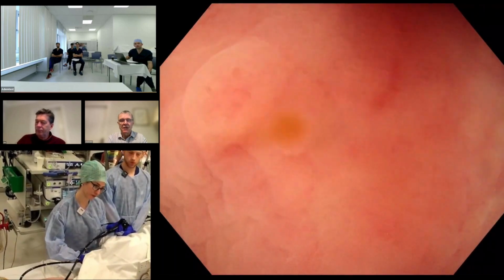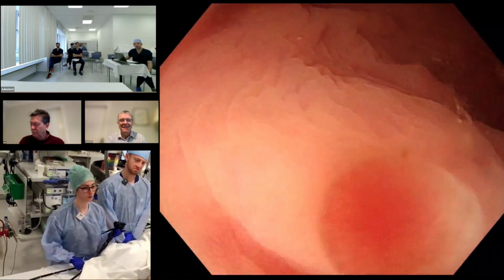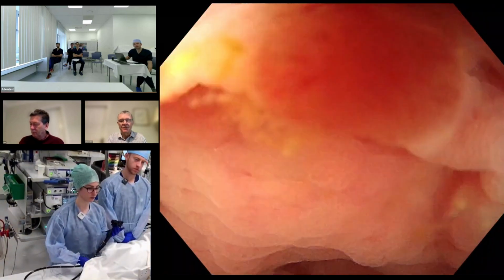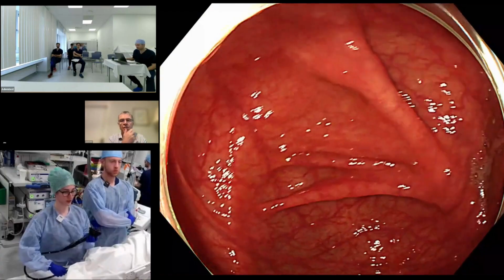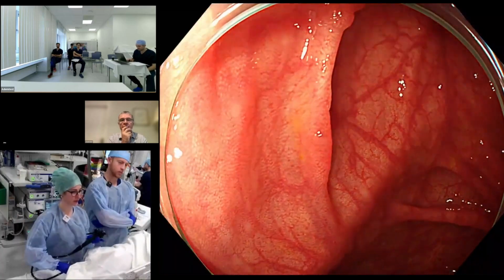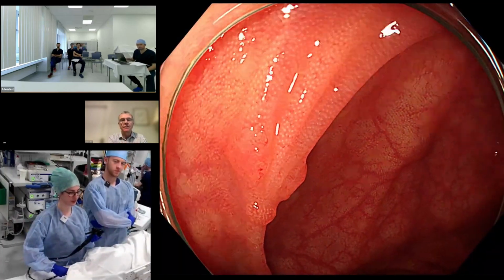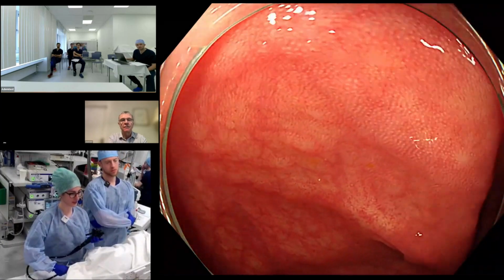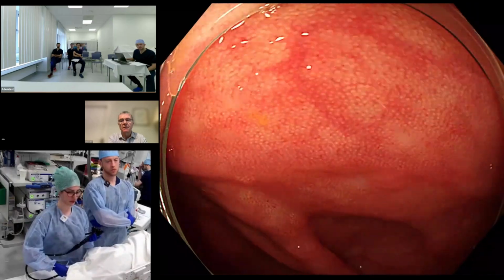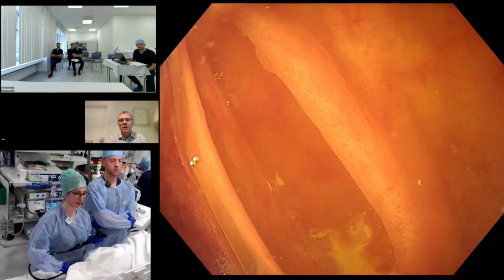Looks like Sandra has straightened the colon out for you. It's helpful. So from behind the valve is the first one, and already I see some polyps. Yeah, and then I want to go around. There's another one there.